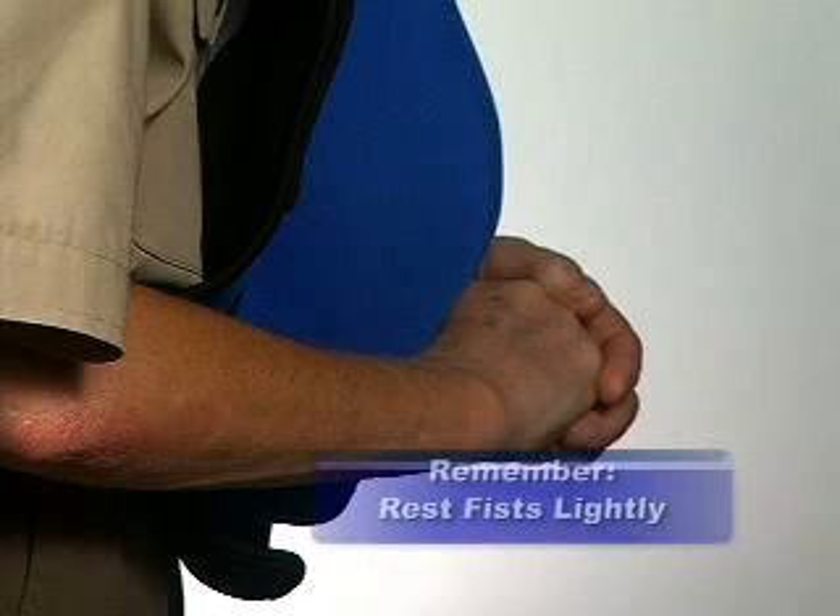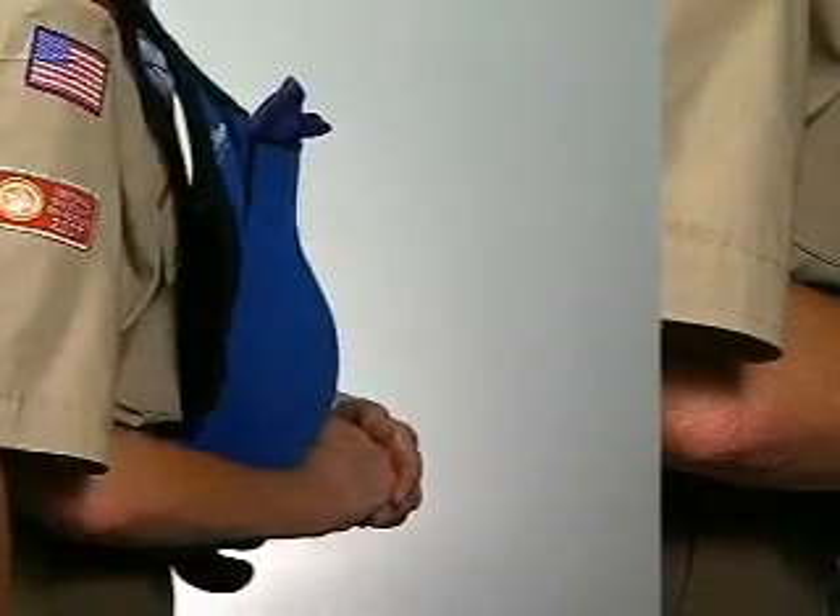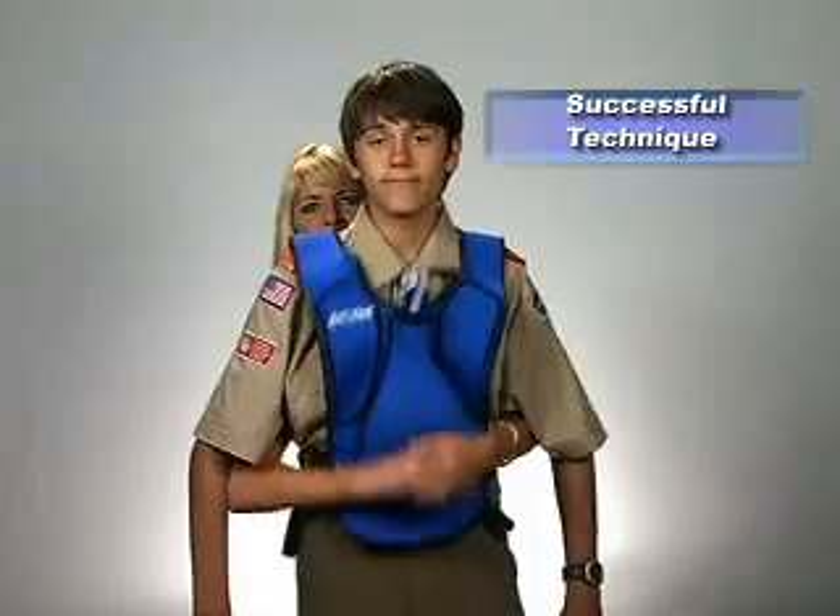Remember, it's important not to compress the bag before starting, but to rest your fists lightly upon the bag. When done correctly, the foam obstruction shoots from the vest, indicating successful technique.